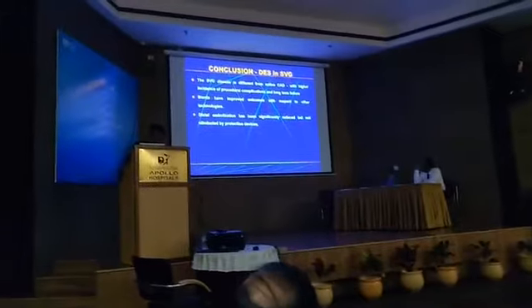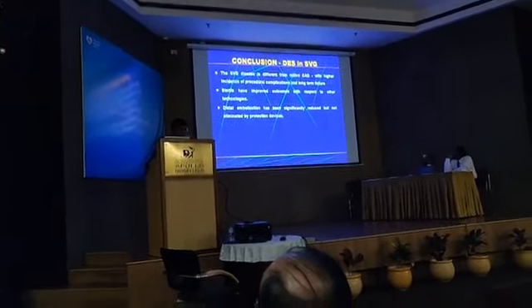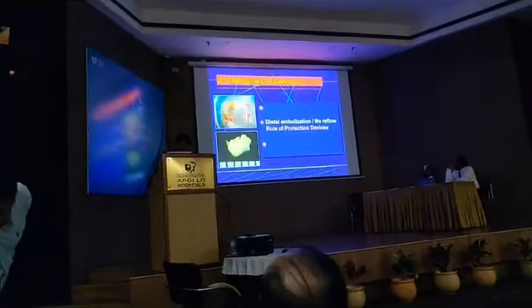So there was no doubt that the drug-eluting stents were doing better, although there was some hesitation earlier to use a drug-eluting stent in saphenous vein graft, and that was taken over very soon. And of course, the conclusion was that all saphenous vein grafts should be treated with drug-eluting stents rather than bare metal stents.